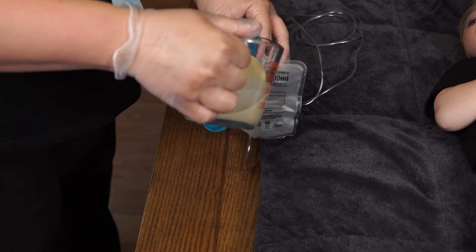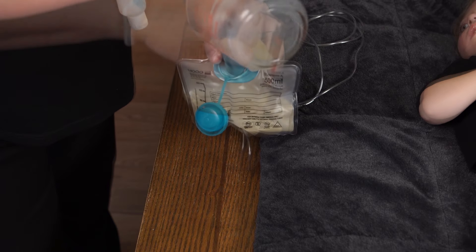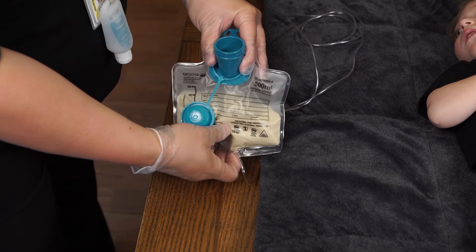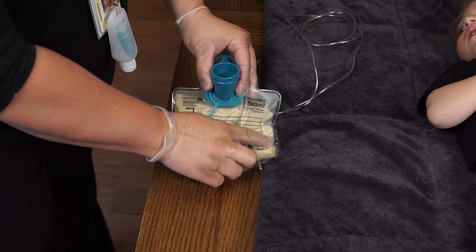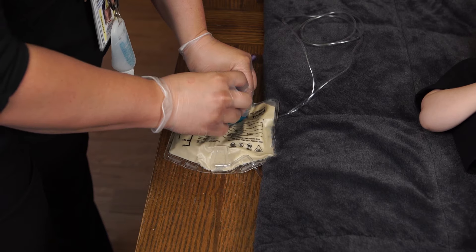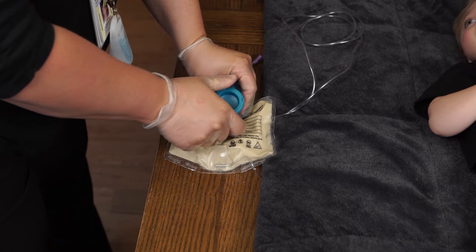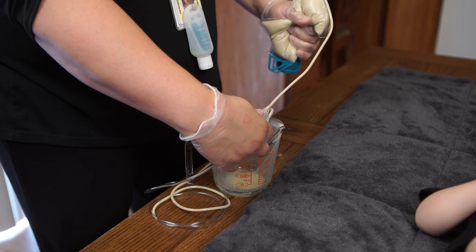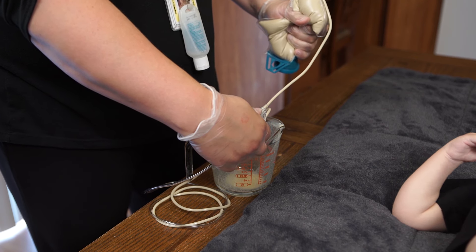Pour the formula into the feeding bag. Hold the feeding bag upright with the bottom of the bag on a hard surface. Remove air from the filled feeding bag by gently pushing down until formula rises into the neck of the feeding bag. Close the cap on the bag. Prime the feeding bag tubing to remove all air using the method recommended by the pump manufacturer.